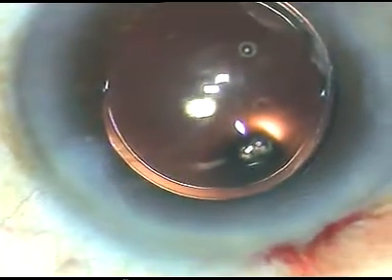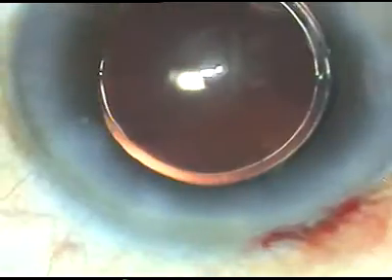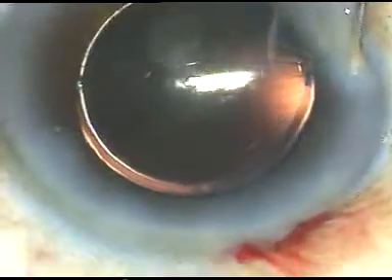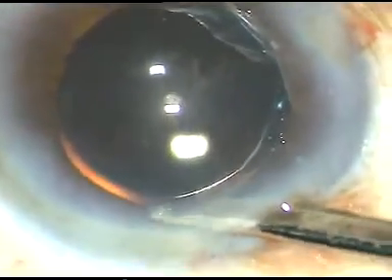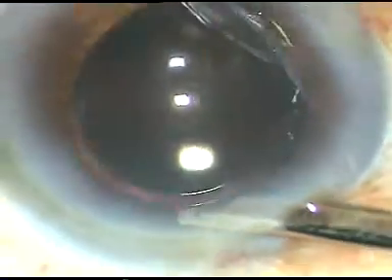Now I hydrate these side ports so that they become watertight. I hope this video will help you in developing your surgical skills. Just form the anterior chamber like this and conclude the case. Thank you very much for your attention.